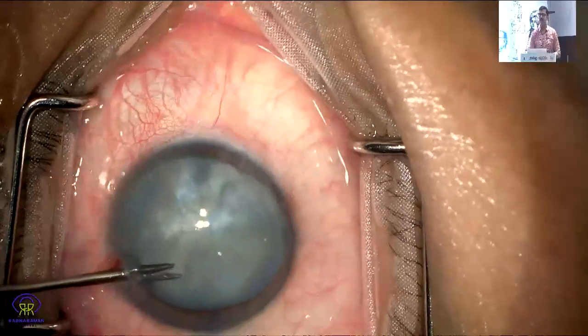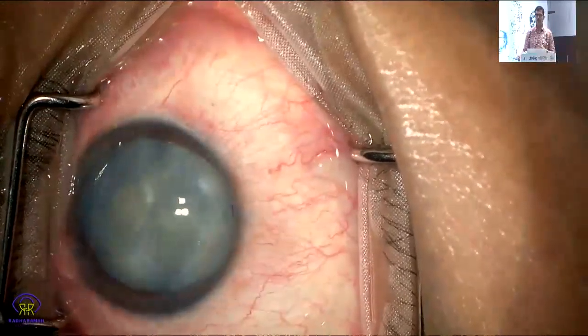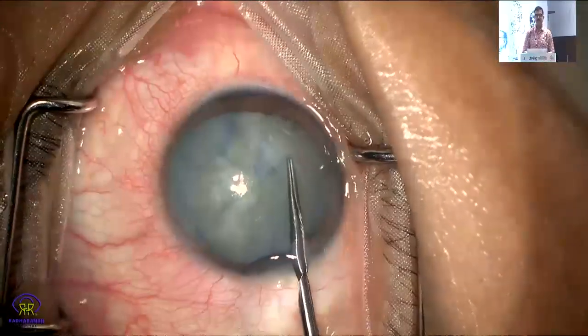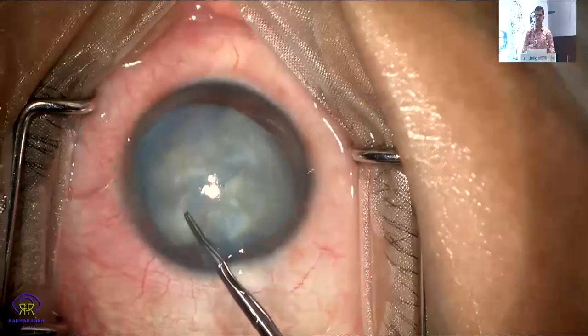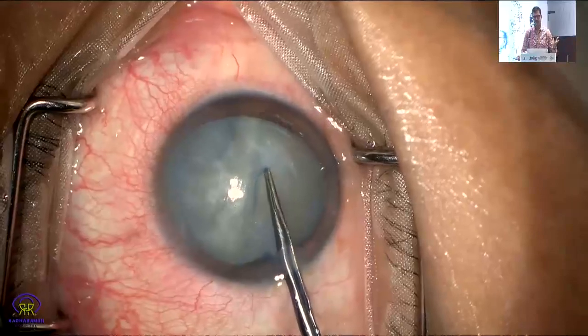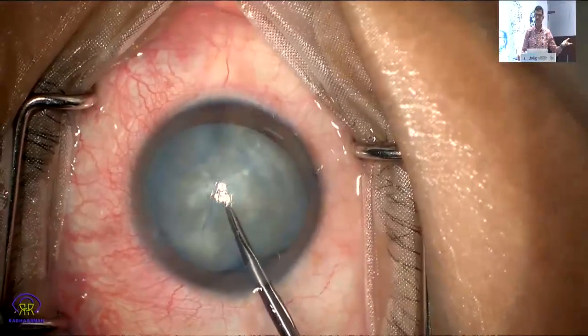What happened in here is, since the cataract was very intumescent and plenty of fluid-filled pockets were there in the mid-periphery, the moment I tried to do a rhexis, it started going out, and the moment I was trying to push in some viscoelastic, it stepped off, and one side of the Argentinian flag happened.